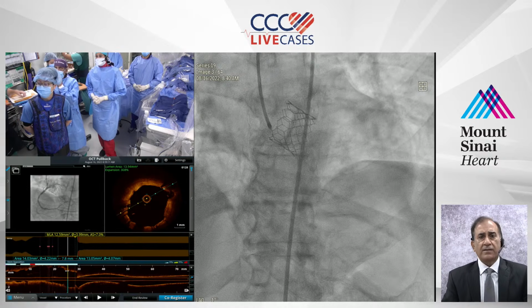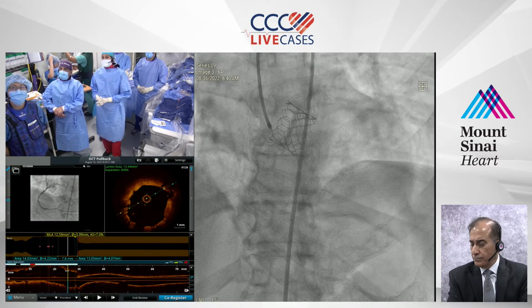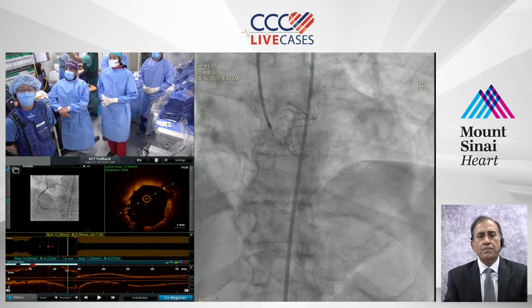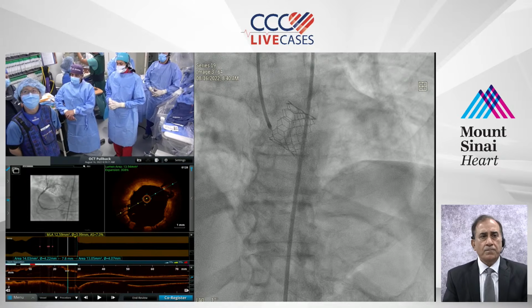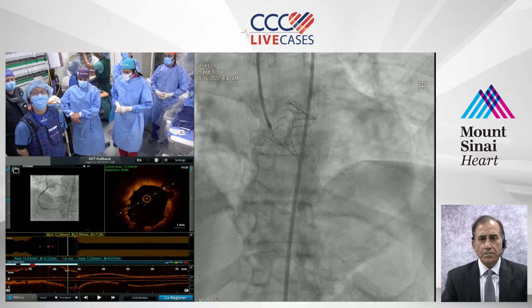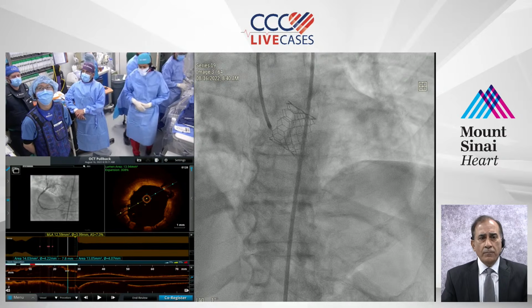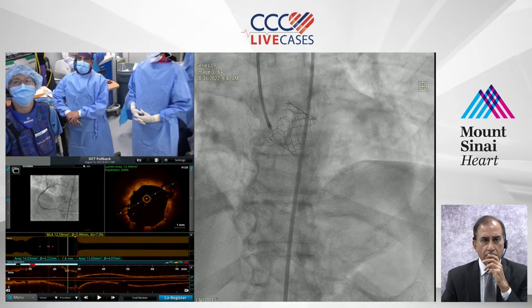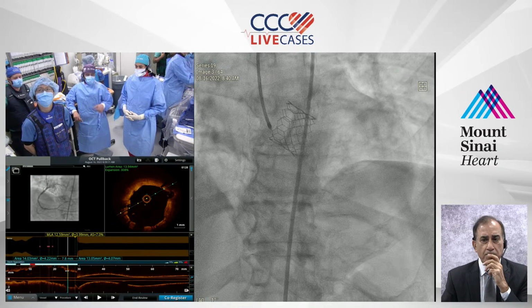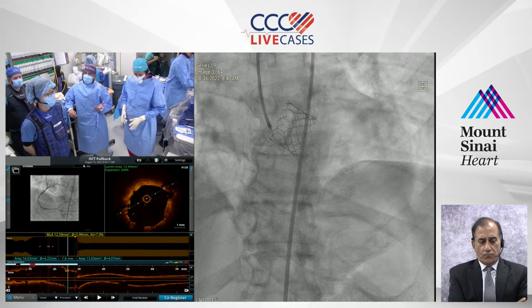Excellent. And as you know, there is a lot of data coming now, particularly for the right coronary, on whether you can avoid giving the dye and do the saline OCT. Now they have tried gadolinium. They are working on another molecule which was just published in JACC. But the key is for the right side, can you do it with the saline OCT? And it seems to be an okay picture. So maybe next time we'll practice the OCT with the saline and see how crisp it comes.